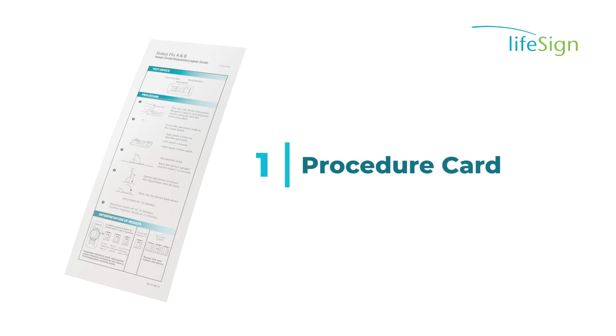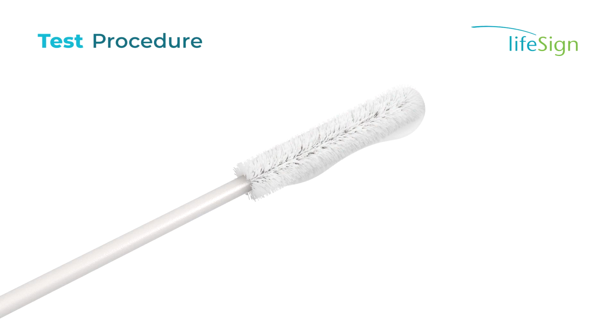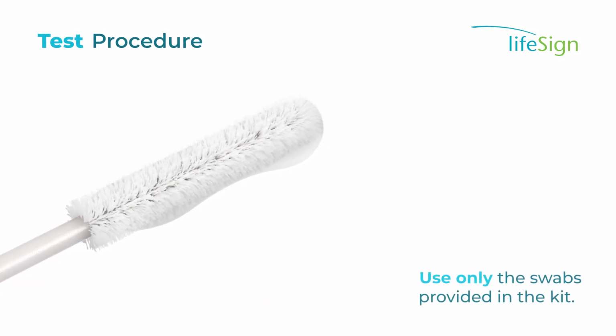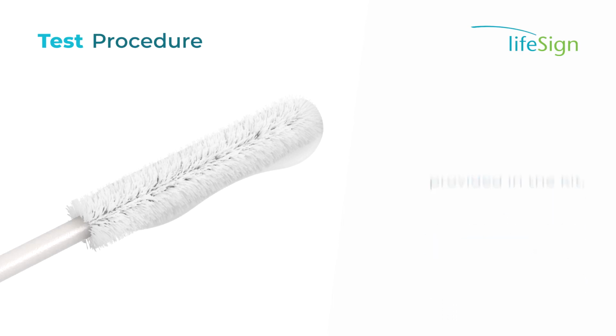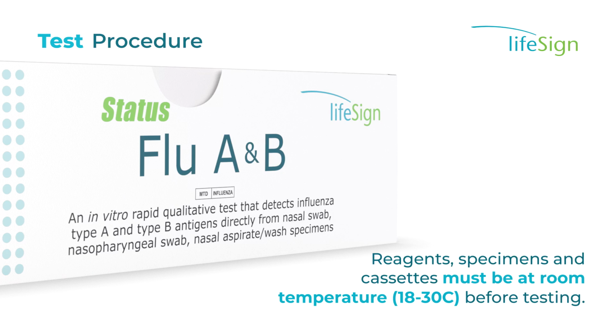Good sample collection is the most important first step for accurate test results. For best results, it is recommended to read the package insert for details on test procedure and external QC before performing a test. Use only the swabs provided in the kit. Reagents, specimens, and cassettes must be at room temperature, 18 to 30 degrees Celsius, before testing.